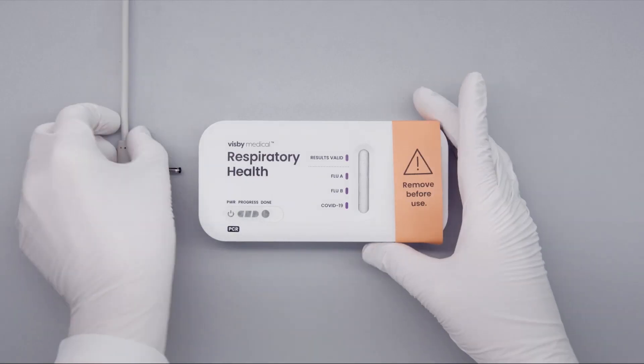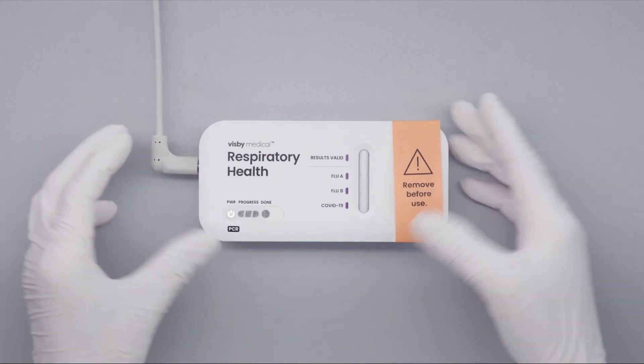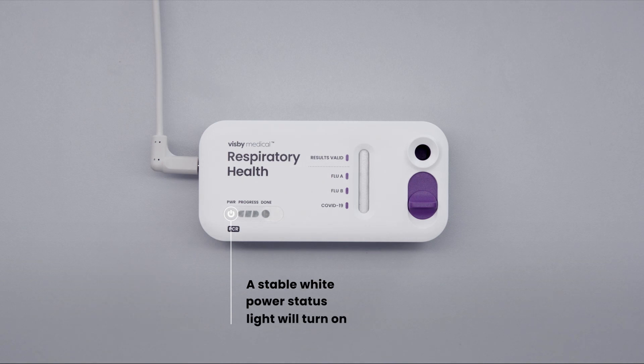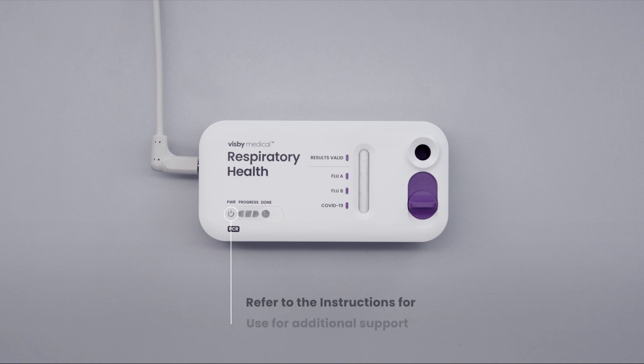Plug the device into the power adapter and remove the protective strip over the sample port. A stable white power status light will turn on, indicating the test is receiving power. If the power light does not turn on or if the power light blinks, refer to the instructions for use for additional support.